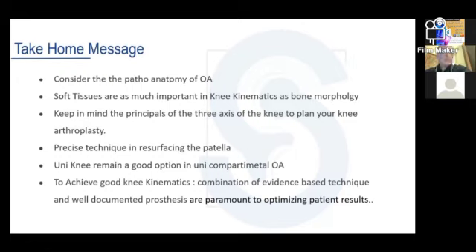One technical question about the transverse axis versus the epicondylar axis. You mentioned that we should align with the transverse axis. He asks how we can do this. It is with the center. You use your cautery to see the posterior condyle, and it is not very difficult.